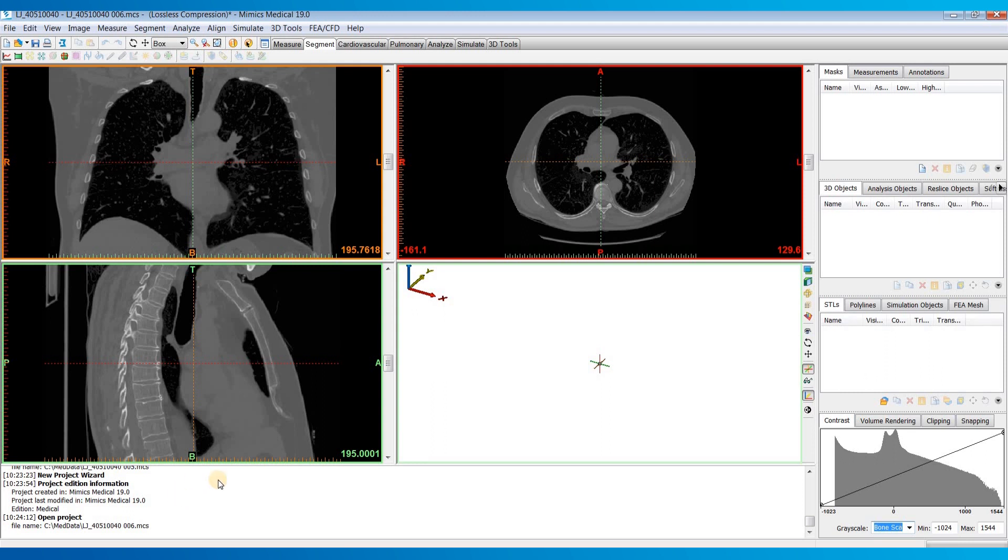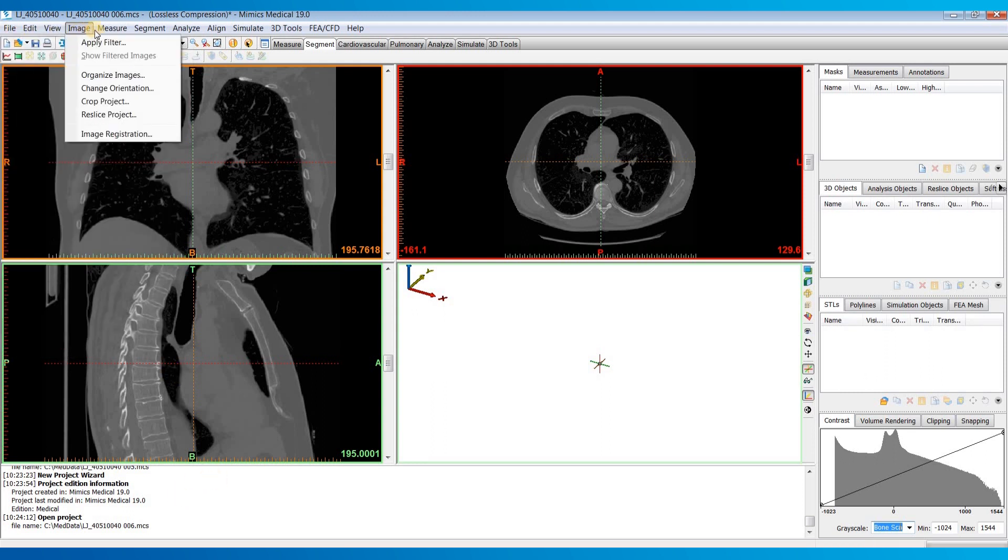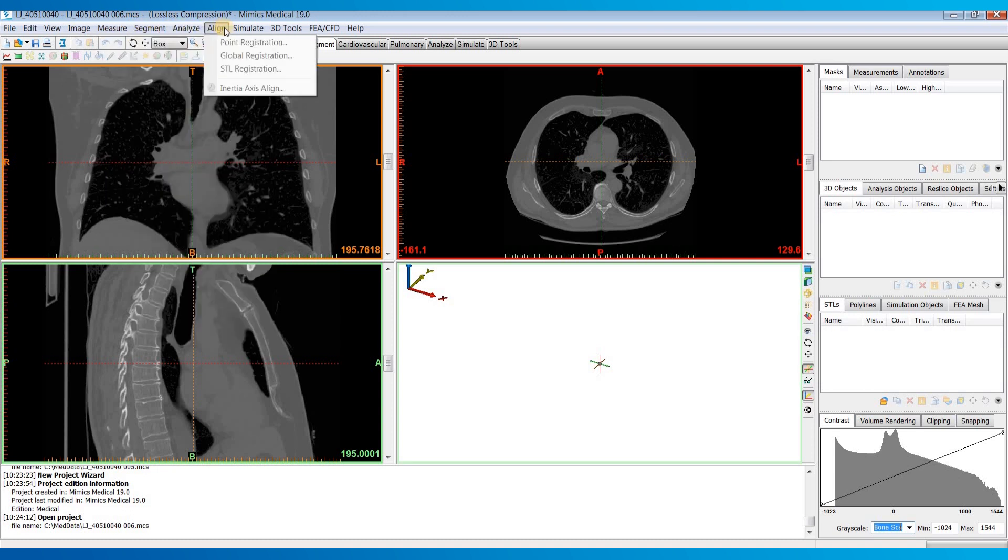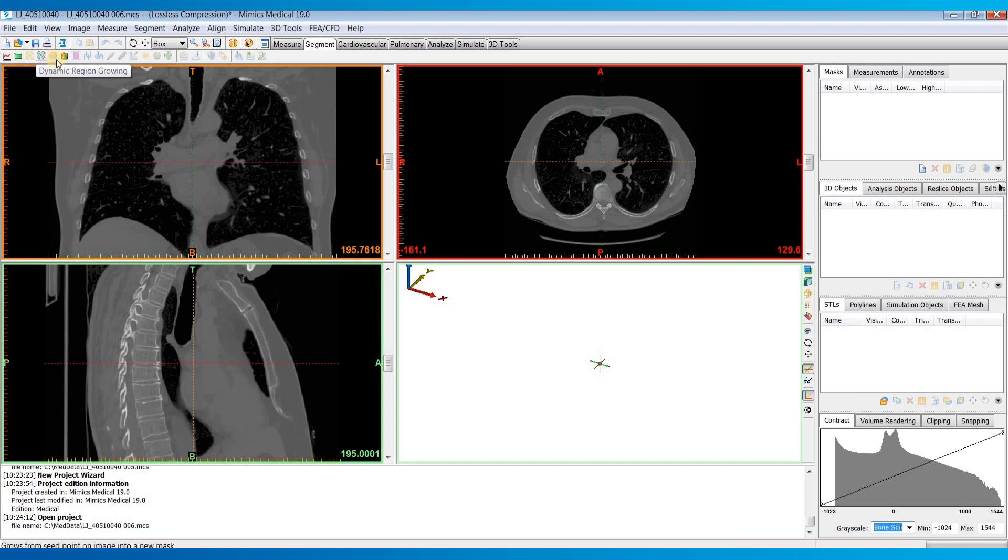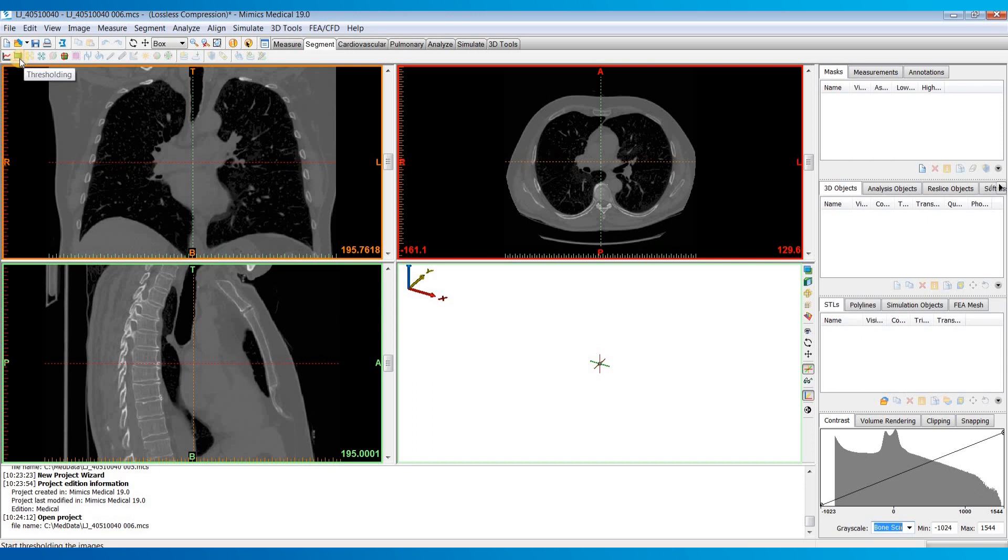Up at the top here we have our main menu dropdowns which will contain all the tools within the software. Below that is shortcut keys corresponding to which menu tab you have selected here. Most of the time I just keep it on the segment tab because those are typically the most commonly used tools that I do.